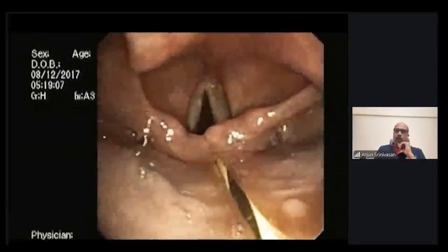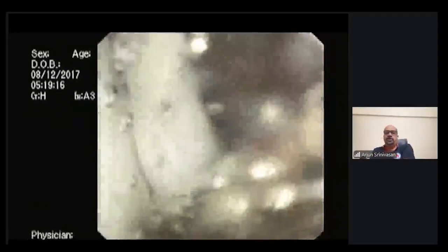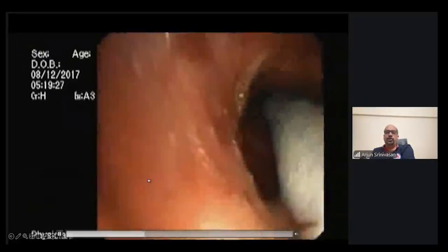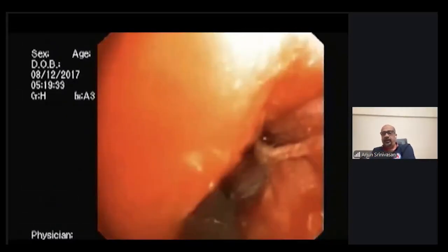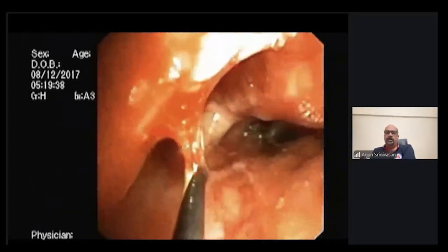And you can see that the guide wire, here again, Dr. Rajiv has published over 30 cases, and you can see that he's able to expertly maneuver it inside through the vocal cord. Again, you need to use a thin scope. When you use a thin scope, the suction may not be great. And these patients have to be relatively stable. If you have got a crashing patient, this will not be a great case wherein you can do this.